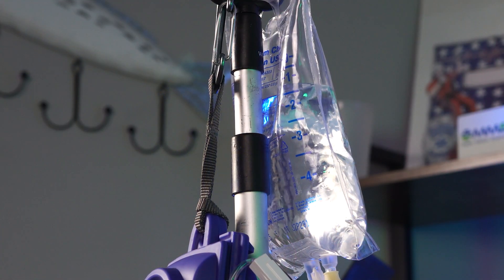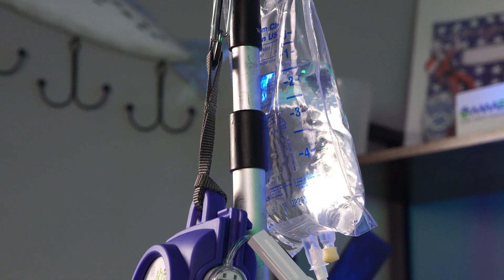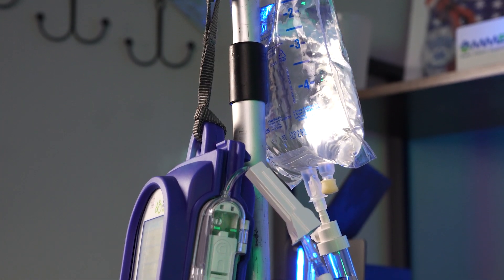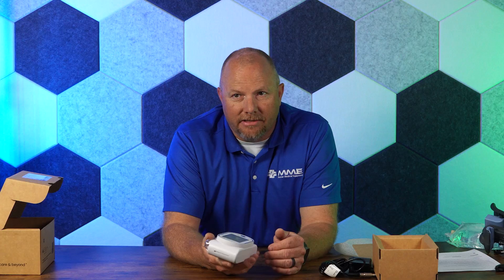With a minimum flow rate of 0.1 cc's an hour and a maximum of 999 cc's an hour, it can treat the full range of patients. This pump being very compact in size, very accurate, and very durable — we think it's an excellent choice for the EMS market.